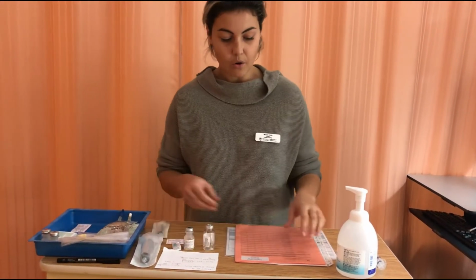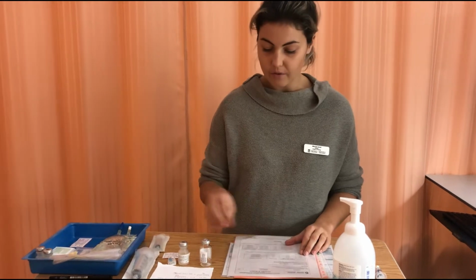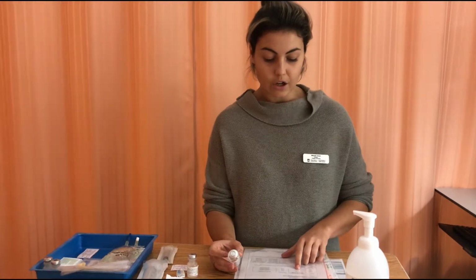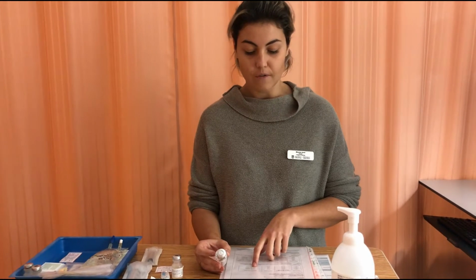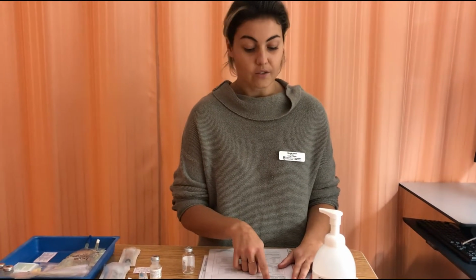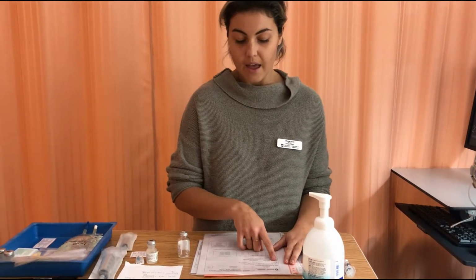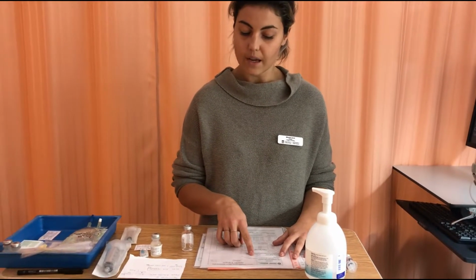Alright, so at this time I'm also going to look at my drug monograph because it has to be reconstituted. It's going to tell me that for the 5 million unit vial, I'm going to add 3.1 milliliters for a final volume of 5 milliliters and a final concentration of 1 million units per mL. While I'm looking at my monograph, I'm also going to note that the classification is antibiotics, that it can be administered by a student nurse, and that the dose is within the usual dose, so it's 1 to 4 million units, so it is appropriate.